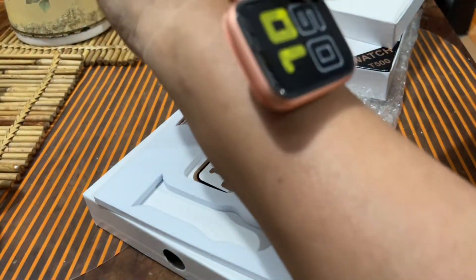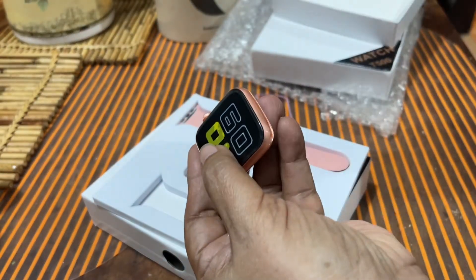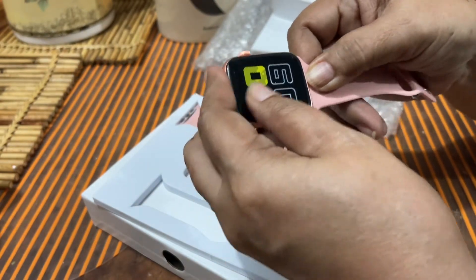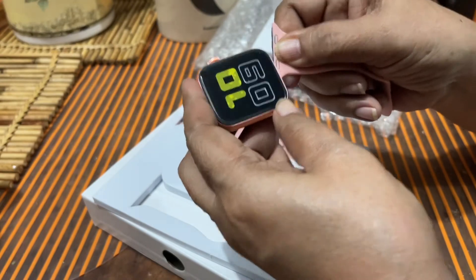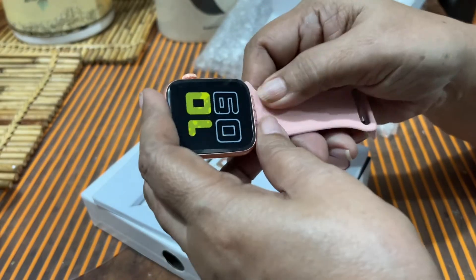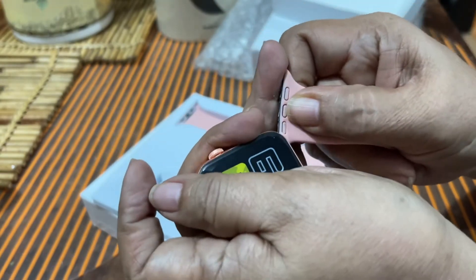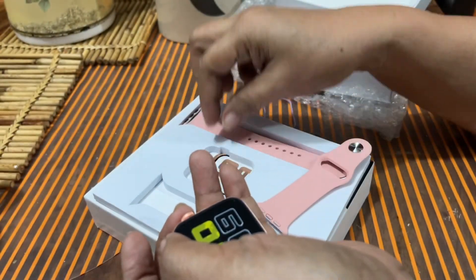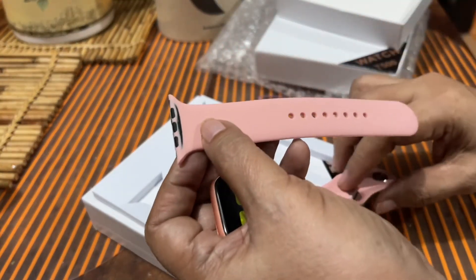Medyo may kahirapan. Tinignan ko muna saan ba pupunta yung parte na to — paano ko ba ikakabit. Medyo mahirap din ikabit, hindi ko din alam kaagad. Subok-subok, subok-subok. Until finally, malalaman ko na it's either you put it in from one side or the other side, then i-insert mo siya dere-derecho. Pag natunan mo yun, it's really simple. That's the proper way to do it. Pag ikakabit nyo, iisipin nyo na kung papaano nyo ikakabit, kasi ako medyo kulang pa yung pagkaka-isip ko — nagkamali ako.